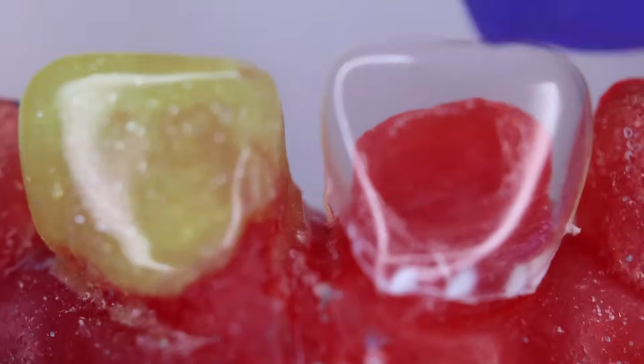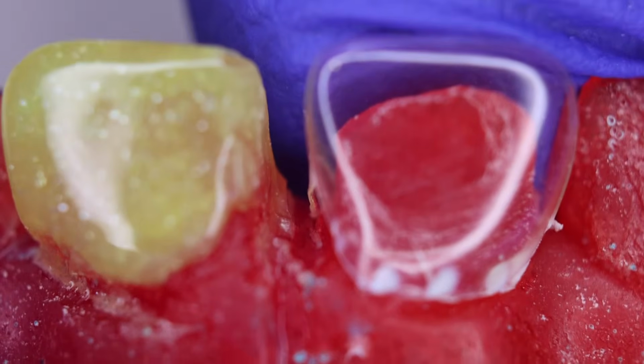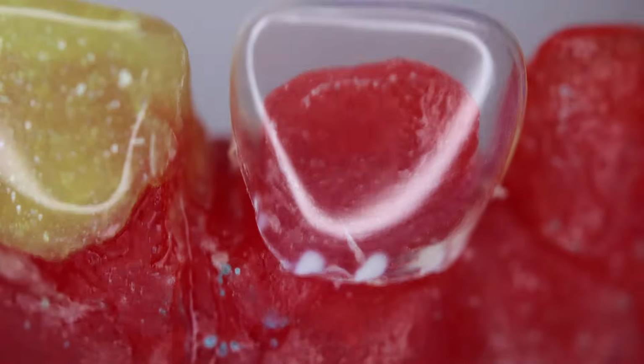This is the crown that you had selected, and it will go up to the neck or the cervical part and should be adapted on both the palatal as well as the buccal aspect, as you can see over here. So the first part is complete, selecting the crown. Now coming to the second part.